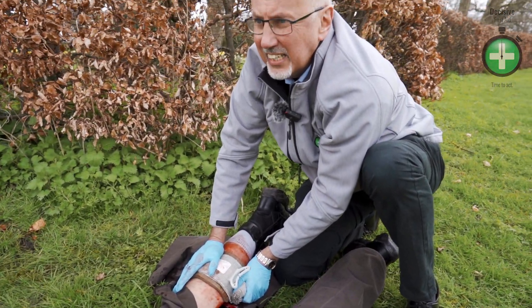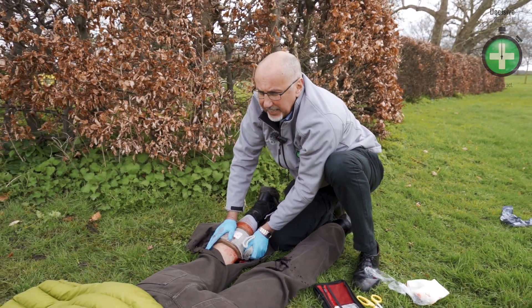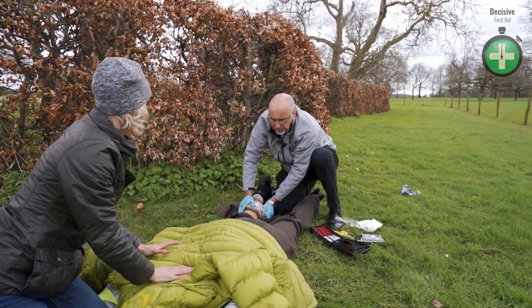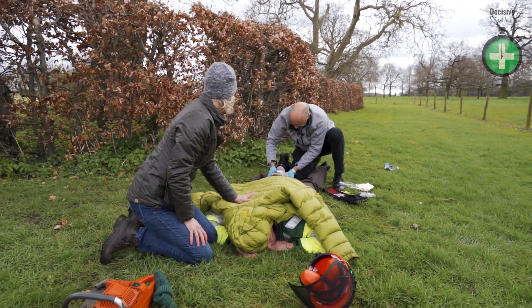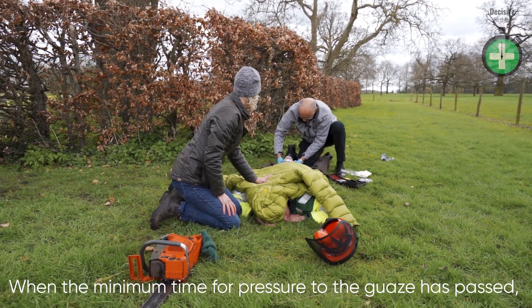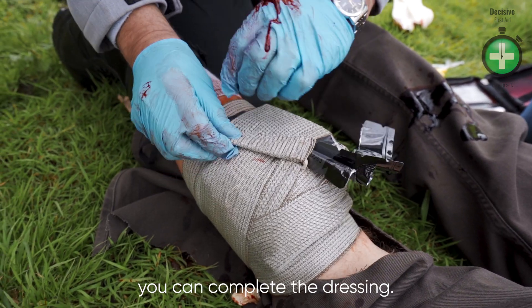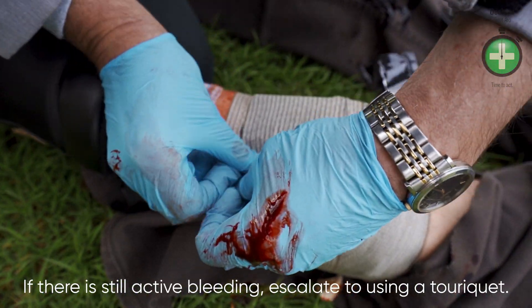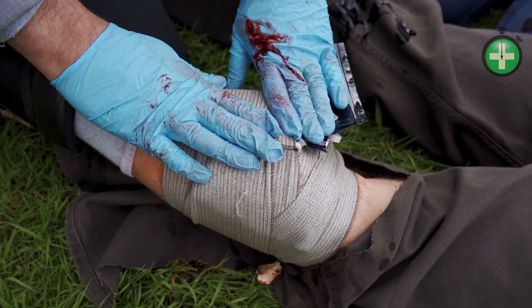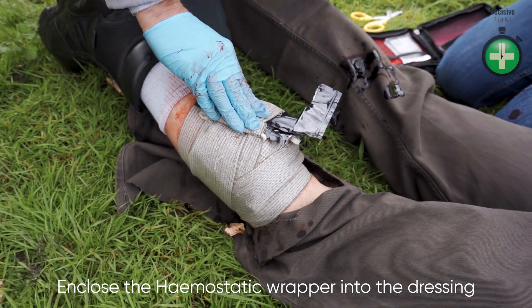We need to call 999 for emergency services. Our patient's got a catastrophic bleed — he has got an airway, he is breathing, but he is unconscious. It's been three minutes, so now I'm going to complete this dressing. I've put the wrapper in there, so when he gets to hospital — here comes the air ambulance — they know that haemostatic gauze is in there.